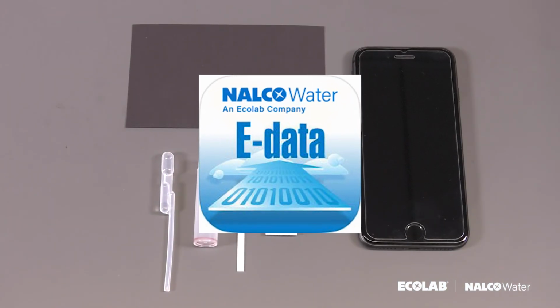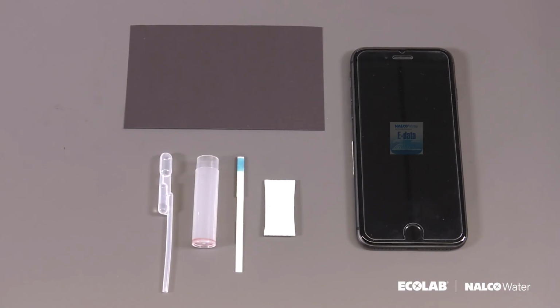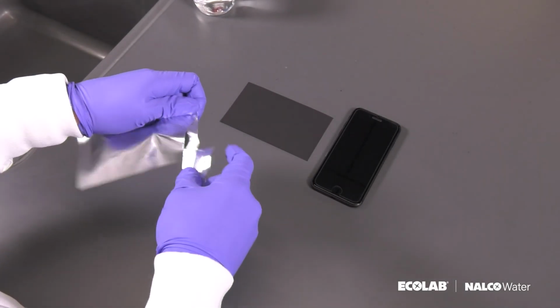After the Nalco Water E-data app has been set up on your smart device, you are ready to get started conducting the rapid bio test today. Open the foil pouch and remove the contents.